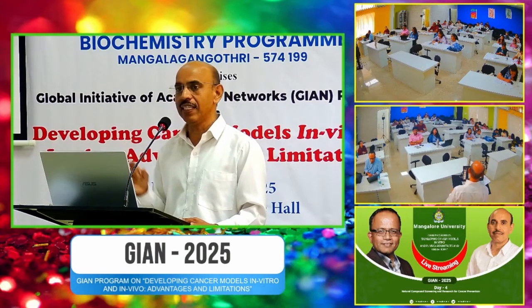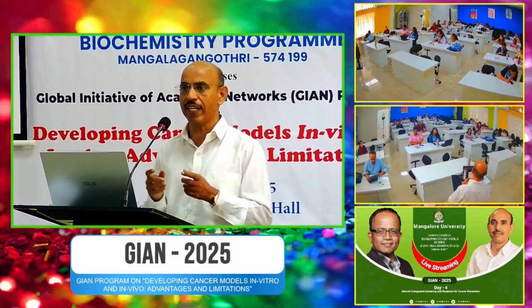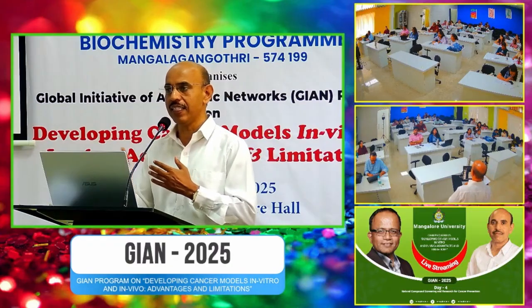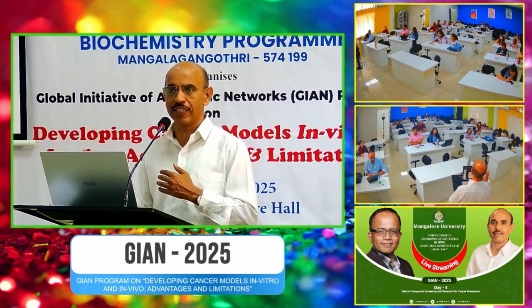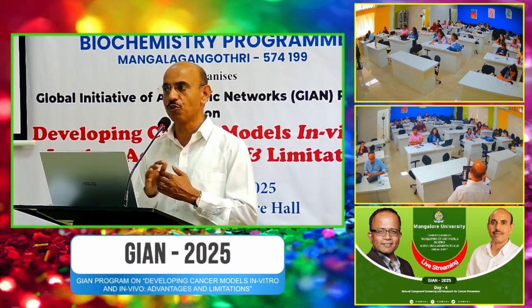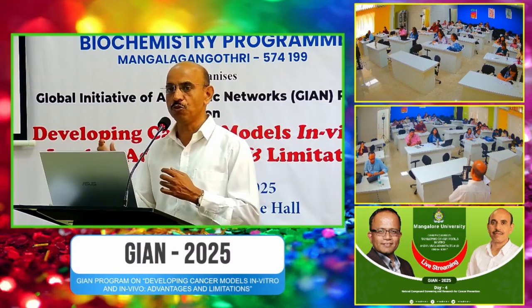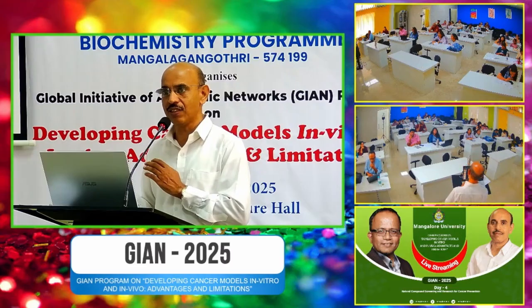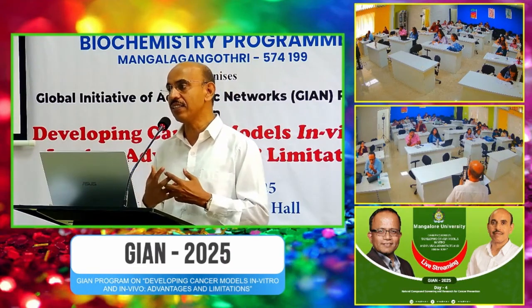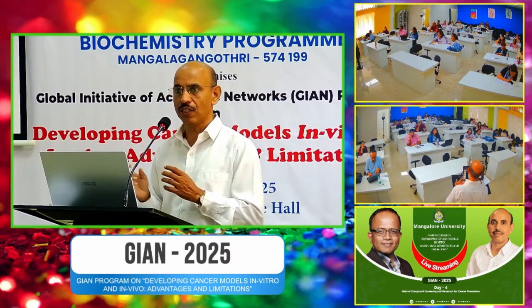The major problem with this HeLa cell line, because I am taking one example and it will be easy to understand, is that these HeLa cell lines can cross contaminate and dominate other cells, and they can grow in that culture, and they prevent the growth of the cells which you are interested in. And they can even transmit through the air also. That's what some studies say. So in such a case, if there is one aggressive cell, and even if it gets transmitted or contaminates through the air droplets, then your study is gone.